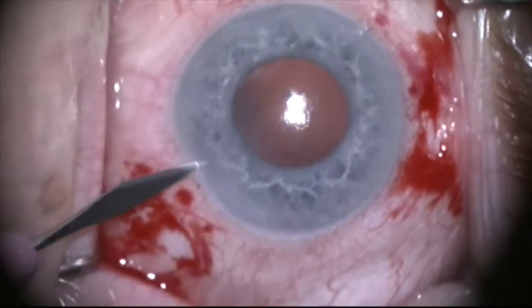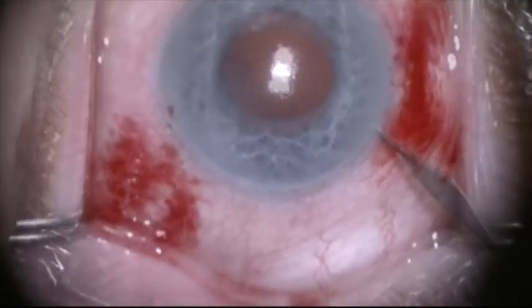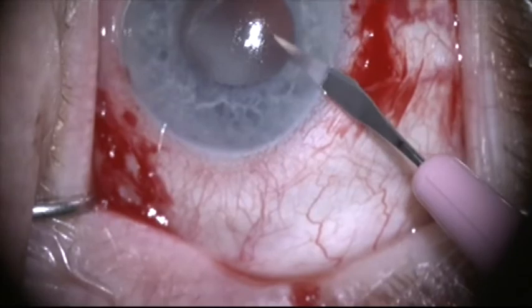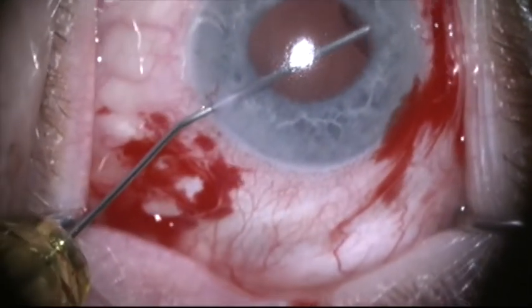This is a patient with pseudo-exfoliation syndrome and a dislocated lens capsular bag complex that is floating in the vitreous. The patient has been referred for refixation of the lens.